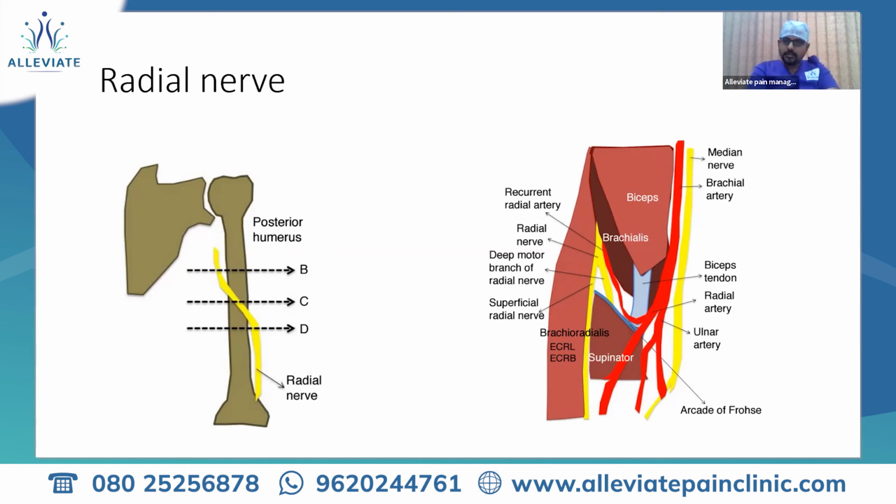At the level of the lateral epicondyle, it divides into the PIN and the superficial sensory branch. The sensory branch continues all the way distally, and it is a part of the anatomical snuffbox. And then, if you follow the nerve, you can appreciate that it crosses over from the first extensor compartment to the second extensor compartment at the wrist.